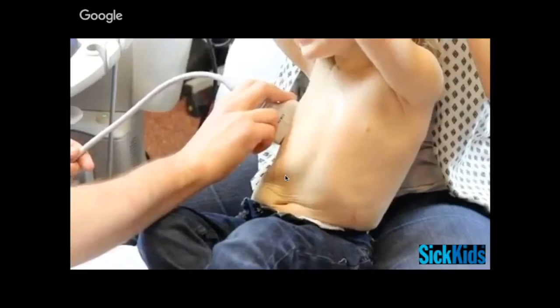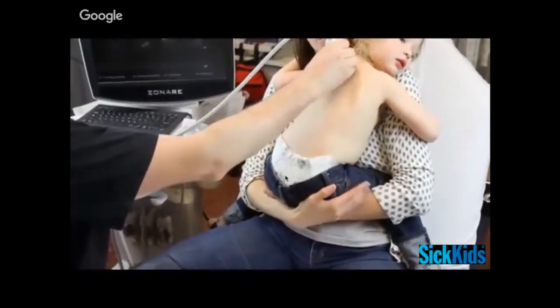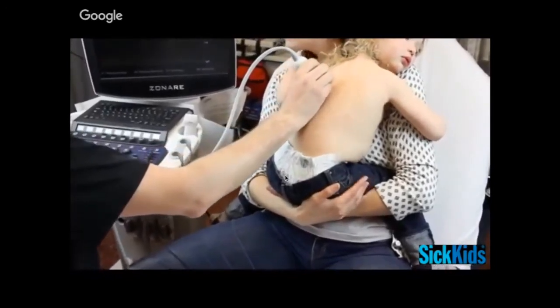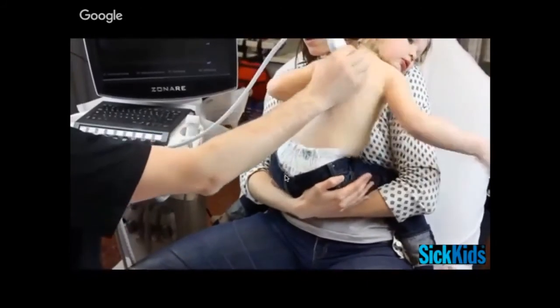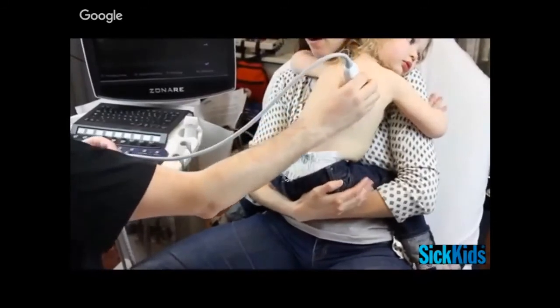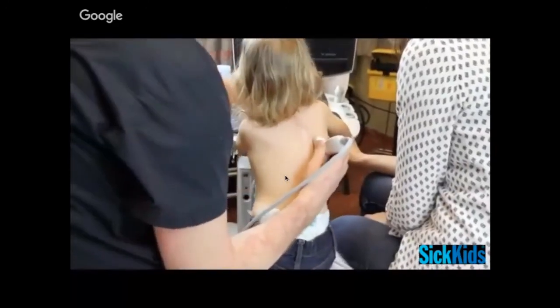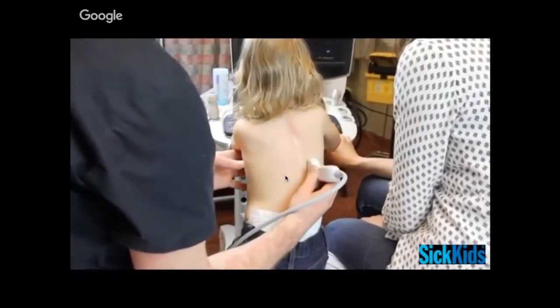To scan at the back, you've got to do something that isolates their hands — this is my daughter Matilda being a great model. To scan the back, you need them to feel comfortable, often holding on to the parent. Often the parent will need to hold those arms up and out to the side rather than underneath the child. If you start at the back first, kids often lose it because they haven't had a chance to see the screen. Toddlers usually need that parental reassurance by being held.